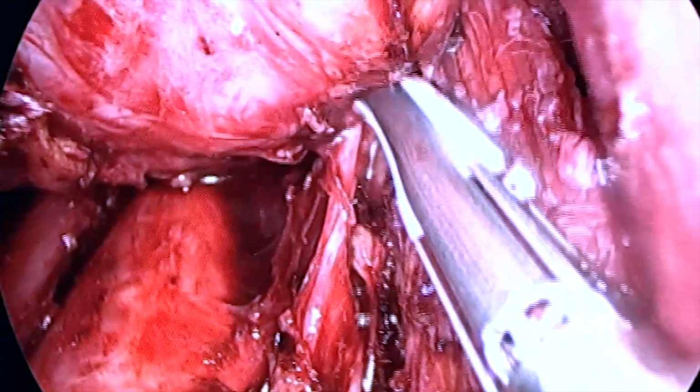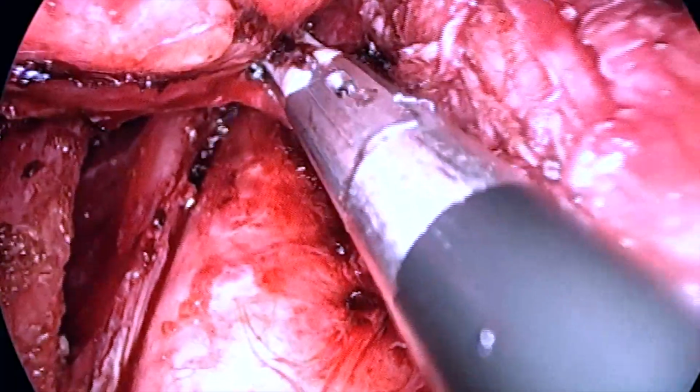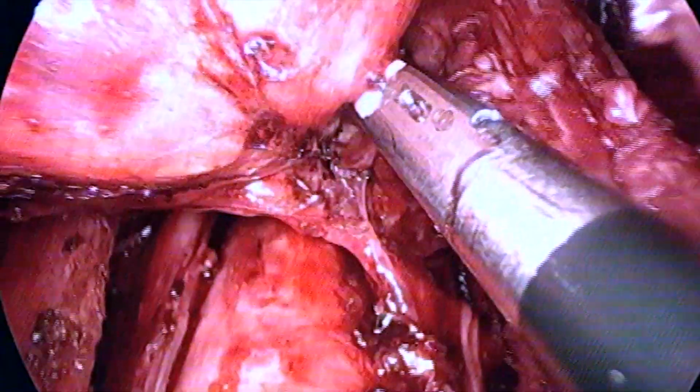The inferior thyroid artery branch close to the thyroid capsule is coagulated and separated. The lower pole dissection is then proceeded to release the entire specimen.